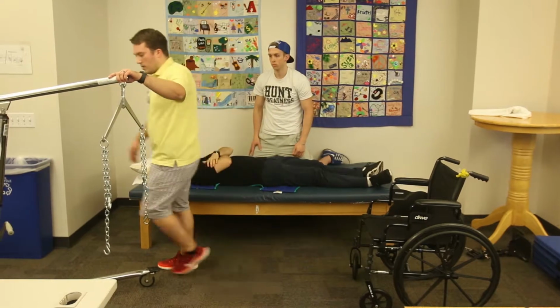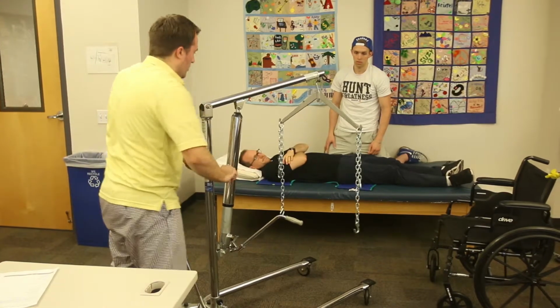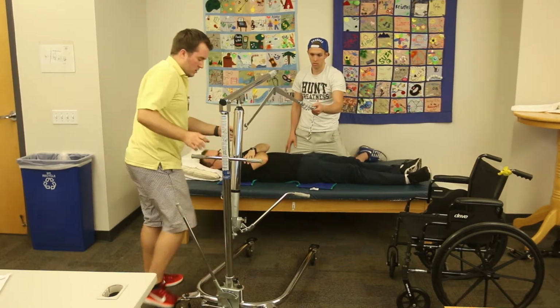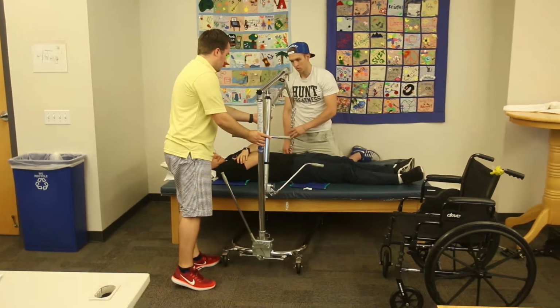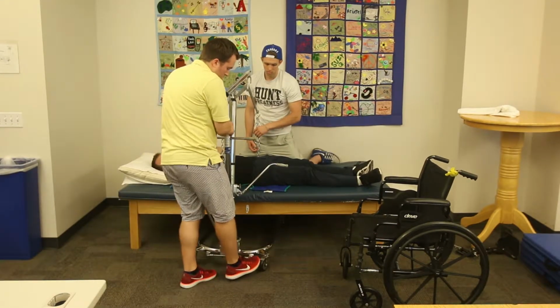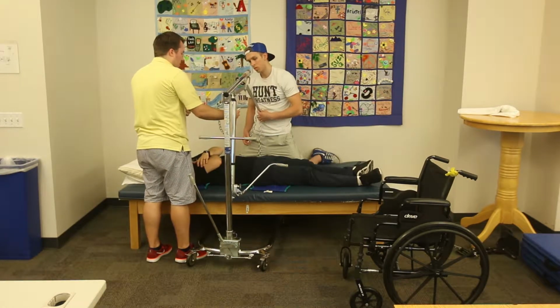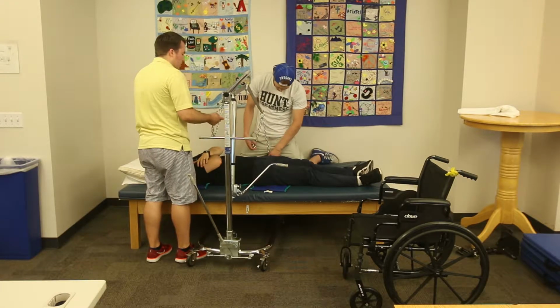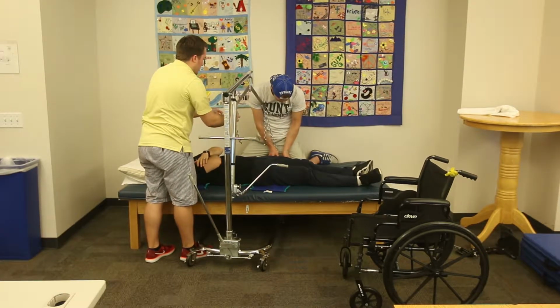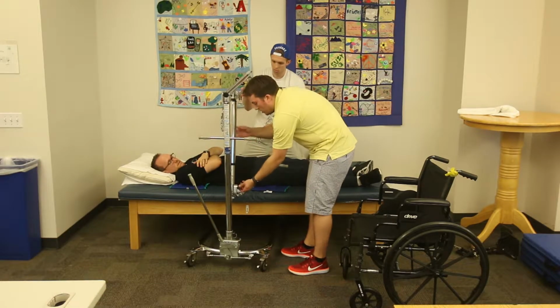Go ahead and get the lift in position. You want to hold that chain as I come across. Perfect. Make sure these wheels are locked. So what we're going to do, Jared, is we're going to take, there's two chains, there's a long chain and a short chain. The long chain is going to go on the bottom portion of the harness with the hook facing away from the patient. Let me lower it down so we can adjust it better. If you want to just hold this while I lower it.